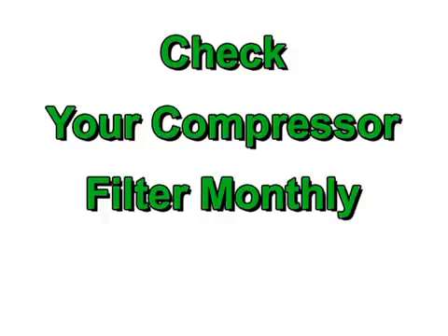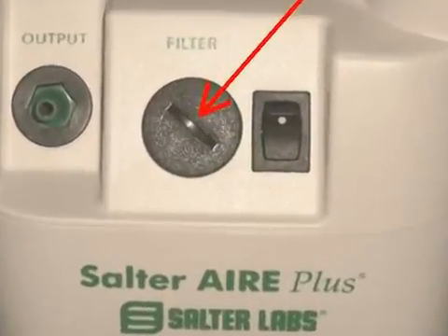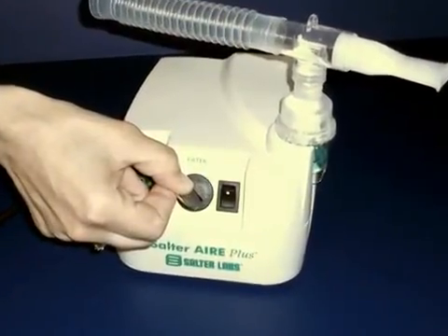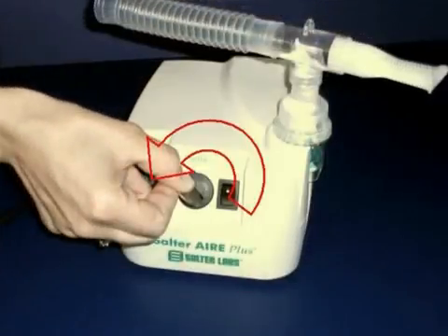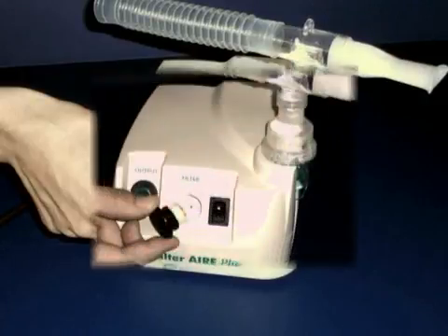You should check the air filter on your compressor at least once per month. To do so, locate the filter cap on the front of the compressor. Insert a large coin into the slot on the filter cap. With the coin inserted into the slot, turn the coin and the filter cap counterclockwise approximately 1/2 turn until the filter cap disengages from the front of the compressor.